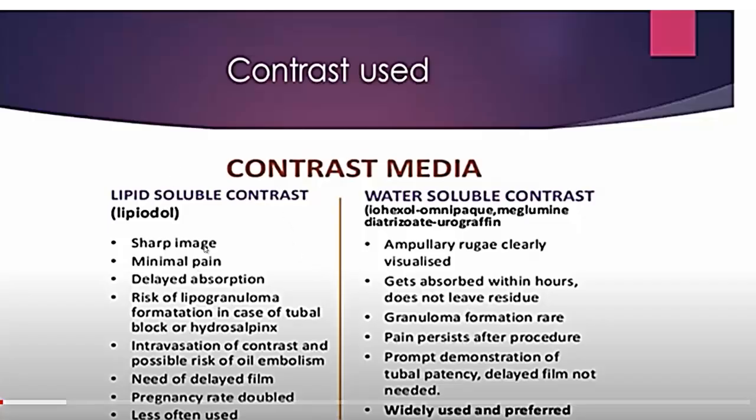Lipid-soluble contrast shows a sharp image. However, the rugae and the ampullary rugae are more clearly visualized with the water-soluble contrast, because it is not so dense. The lipid-soluble contrast causes minimal pain, while the water-soluble contrast gets absorbed within hours and does not leave any residue, and it is more painful.